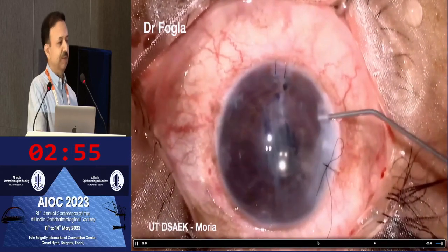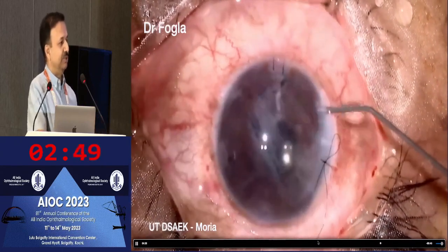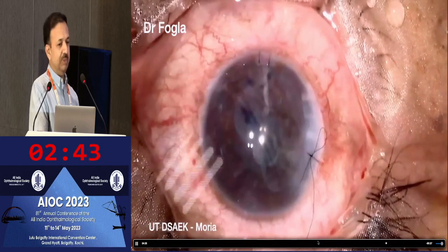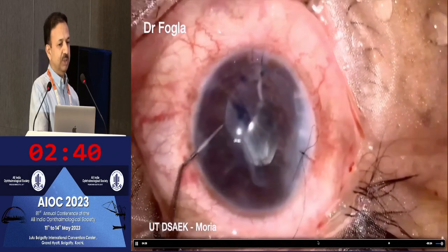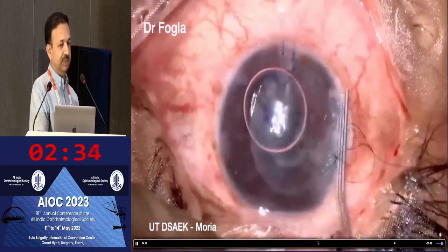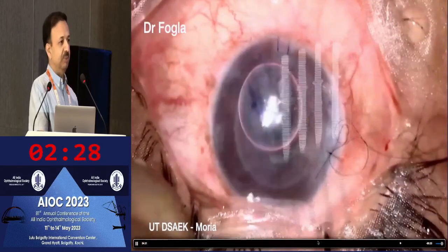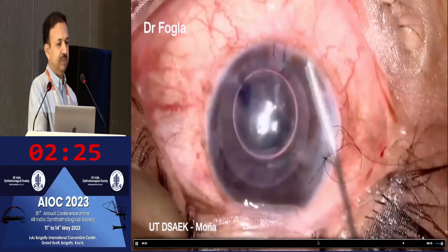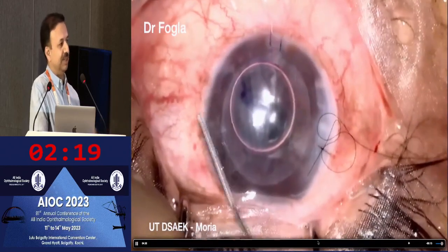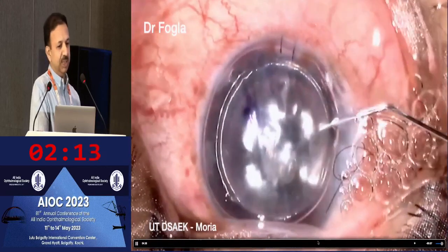Because we put a little cohesive viscoelastic on the surface when folding the graft, the folds get stuck in the viscoelastic, so it takes a little time for them to open up. Once it's opened up, you put an air bubble below the donor disk. As the air bubble is placed within the scroll, it opens up. To move the graft, you need a bubble slightly smaller than the graft size — a large air bubble pins the graft against the host stroma, making it difficult to move. Once well centered, you can put in a large air bubble.